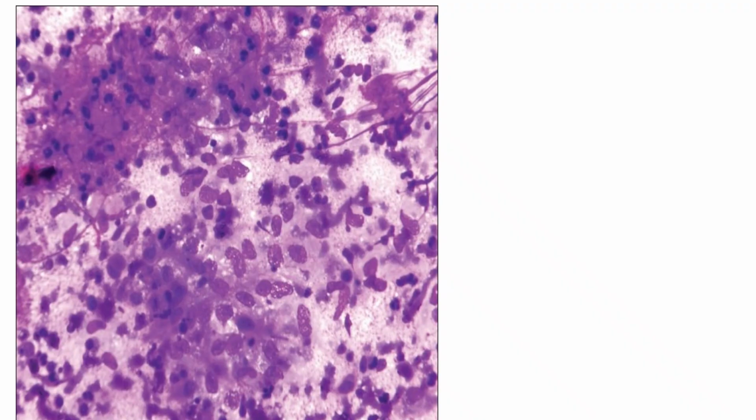Now, this kind of slide can be quite confusing for people who are new. I will say that you get neutrophils here, you get epithelioid histiocytes here, you see fibrin strands here, you get necrosis here. Once you see neutrophils, will you think about infection?